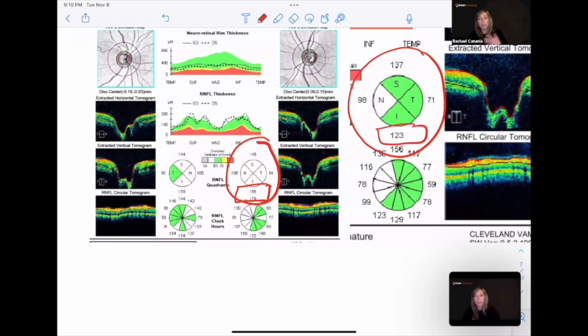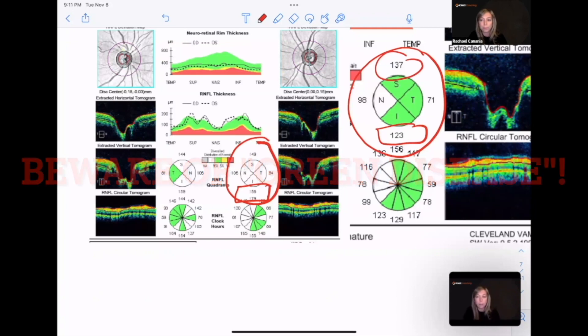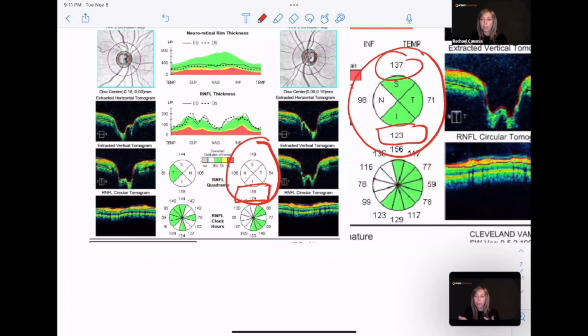He used to have a really robust nerve fiber layer. Now it's still green but it's down over 20 microns, which is still not good. Even the superior quadrant is coming down as well. This can be really tricky, definitely looking like glaucoma in the left eye.